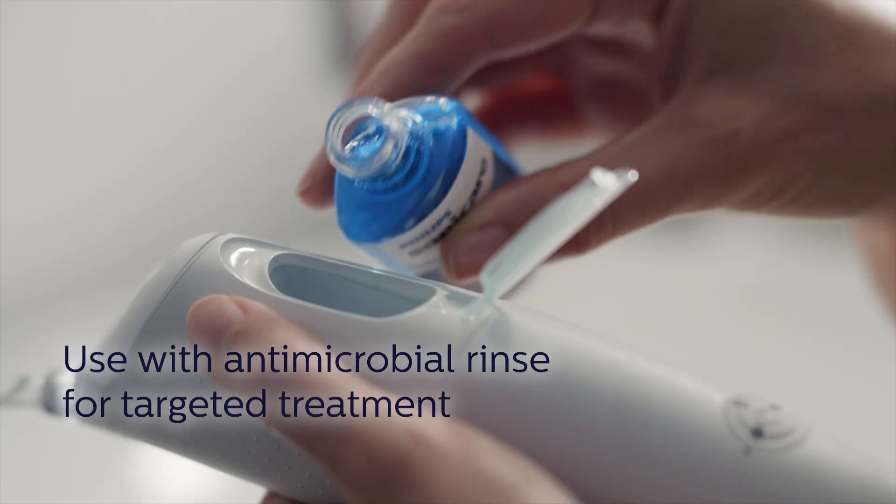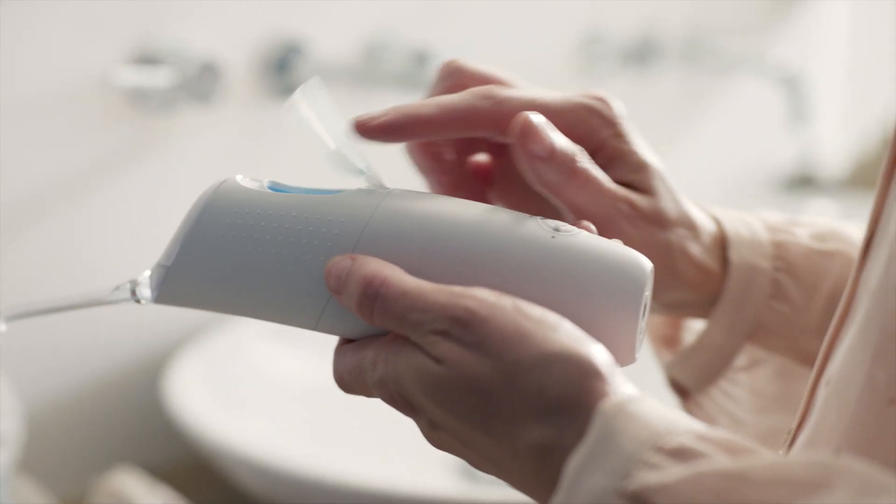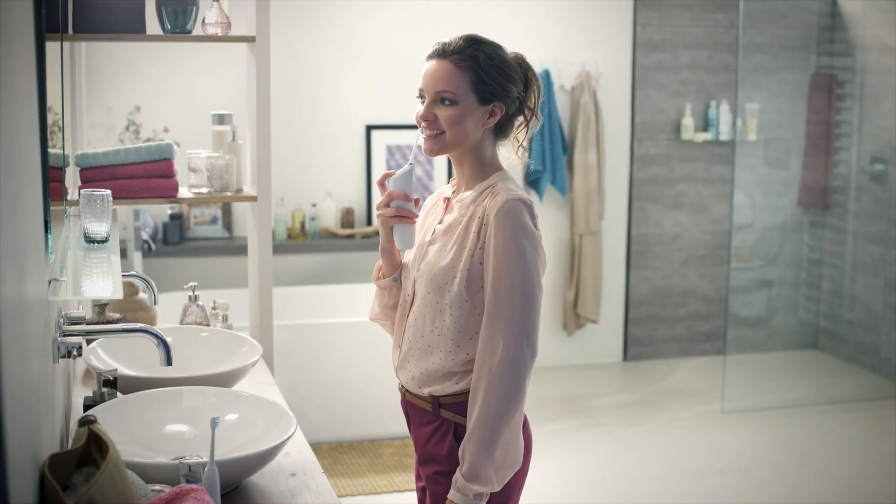Patients can use Air Floss with water, or for an even more targeted treatment, they can fill the reservoir with antimicrobial mouth rinse that wipes out harmful bacteria.